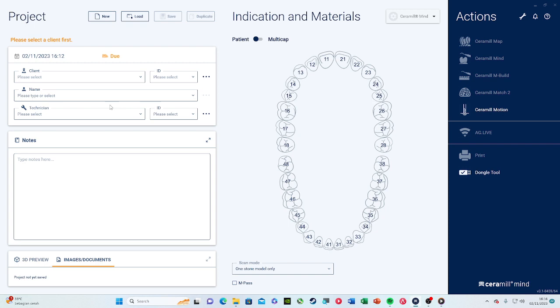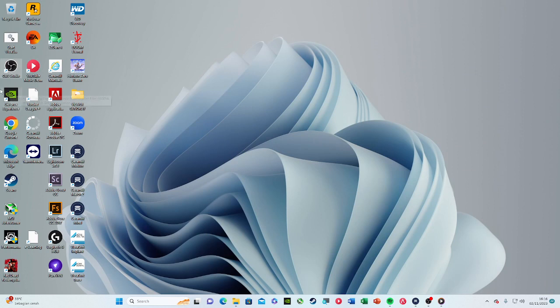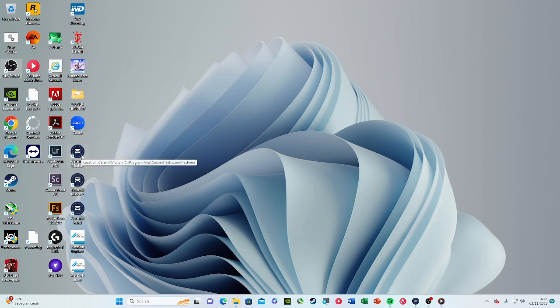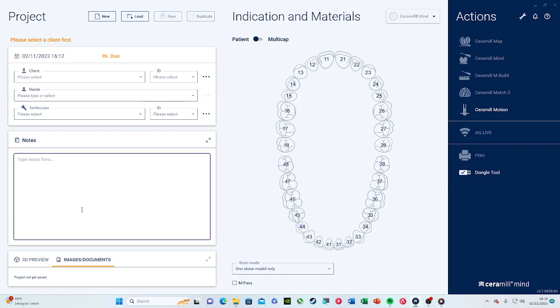This is the software — Ceramill Mine is the design software. On the other side there is Ceramill Match, which is the nesting software, and Ceramill Motion is the software to run the milling machine — a five-axis hybrid machine. But today what I'll be talking about is Ceramill Mine, the design software.